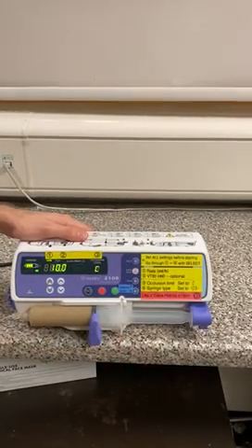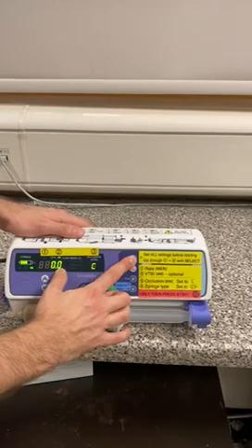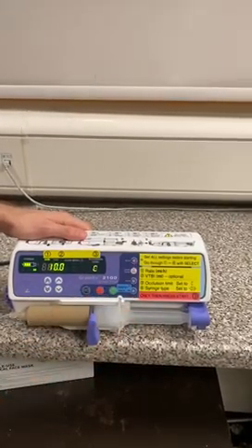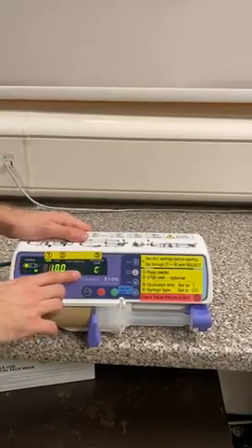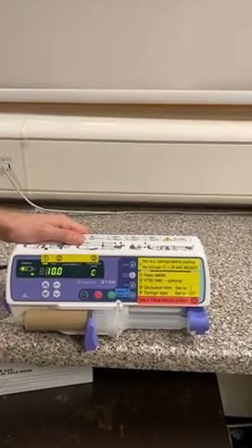If I want to see what my volume to be infused was, all I need to do is hold the select button and it shows me that it was zero. When our infusion is near empty on a continuous infusion, it will display 'near empty.' But if you set a volume to be infused, it won't alarm when it's near empty — it will only alarm when it is empty.